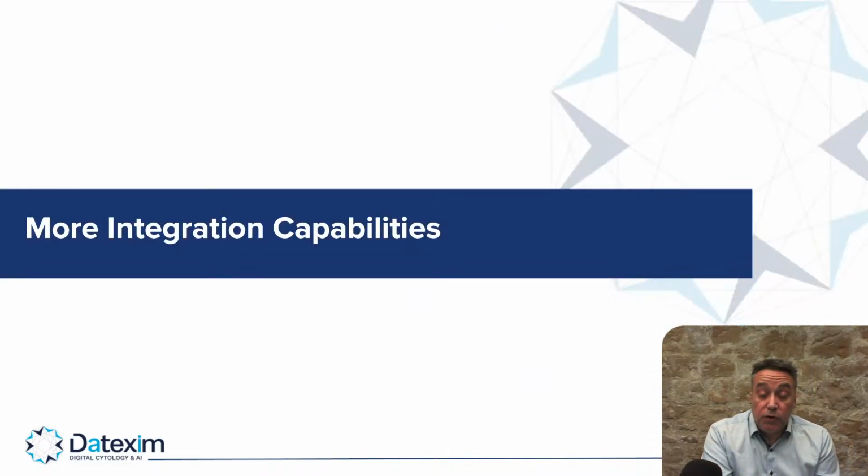So what is also really important with CytoProcessor is integration capabilities. It's a big advantage when you work with us. We are able to integrate to LIS, IMS, and even go deeper with you if you want. If you give us some specification, we can develop specific messages, for example, to integrate deeper with other systems of your lab.